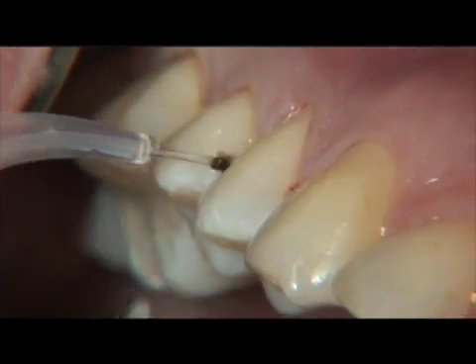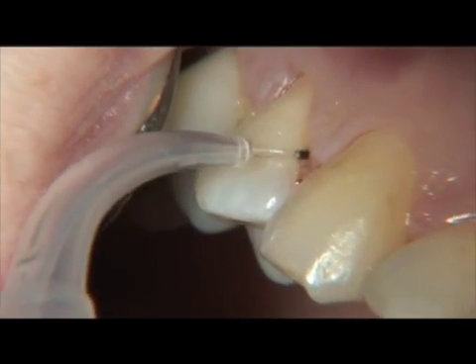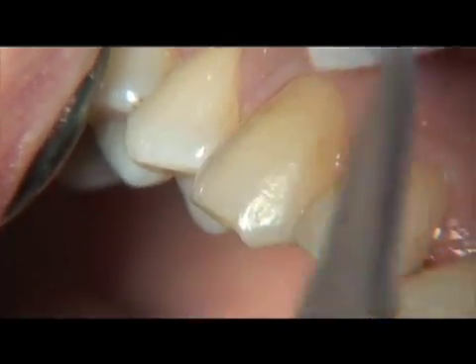The chief advantage of laser curettage is that it allows for a non-surgical approach, gaining easier access to deeper calculus deposits following ablation of diseased epithelium and hemorrhage control.